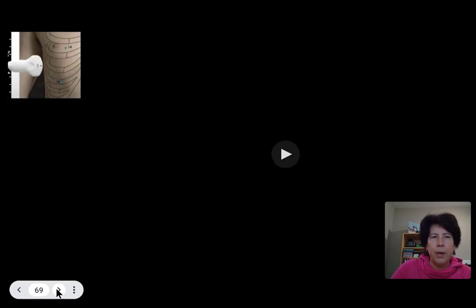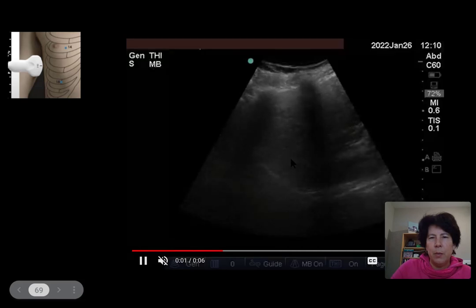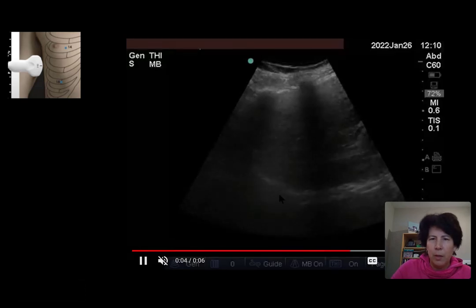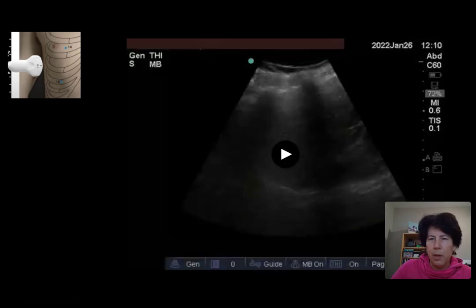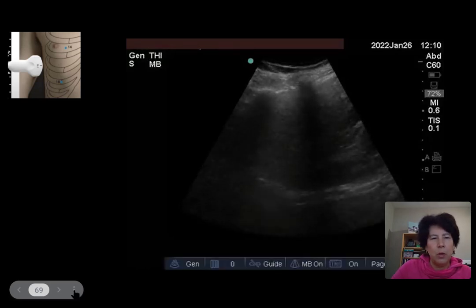And then we go to the diaphragms, we get that right subcostal, want to make sure we see our spine, we see our diaphragm, see our kidney interface for our, if we're doing a FAST, when we're looking at lung, we're mostly looking here. You can see that this patient had fairly bad COPD, so the curtain sign was not as clear. But remember from that previous patient how that lung can sometimes come down over here and shows that very nice curtain sign. So not as much lung movement here, but that's sometimes just how it is.